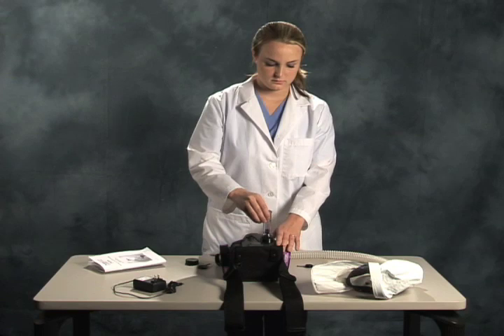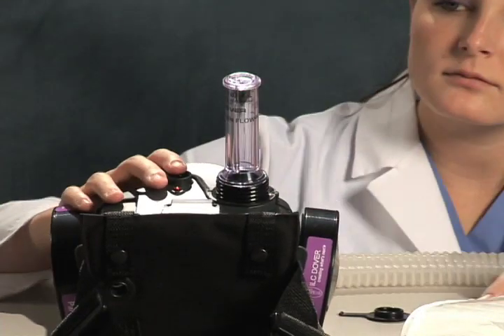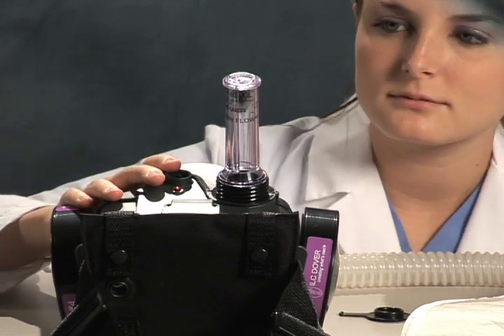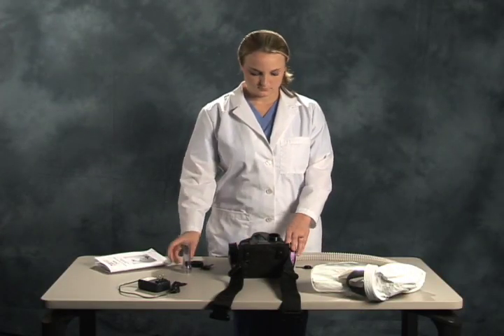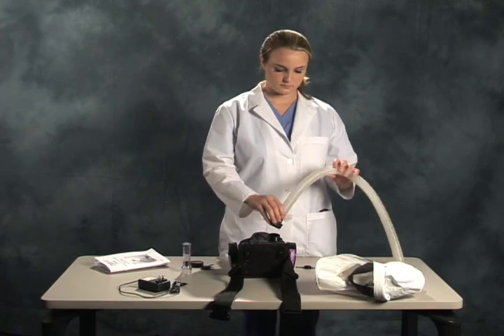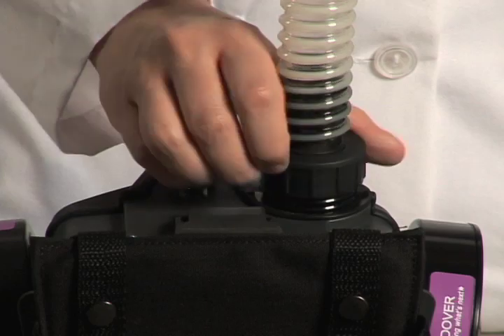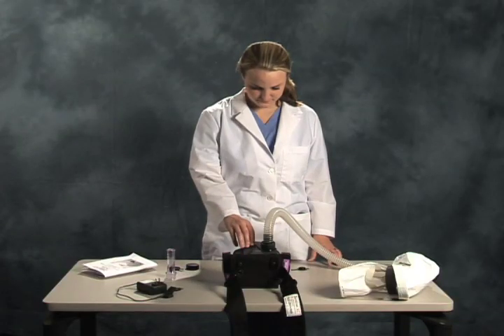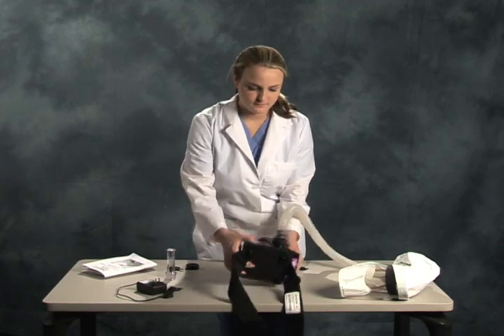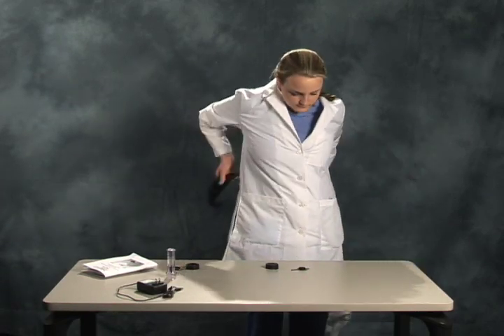Now confirm the airflow rate by using the flow meter included with your kit. Attach the breathing hose by threading it onto the blower assembly. Secure the blower around your waist and connect to the head cover.